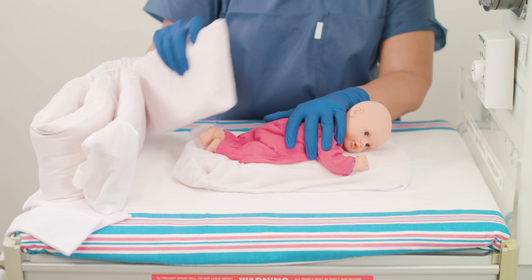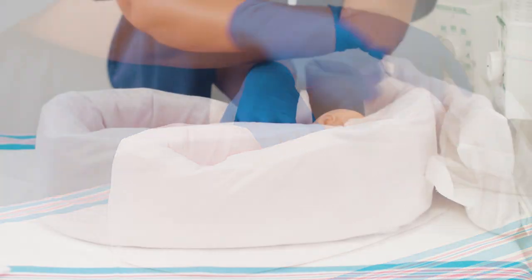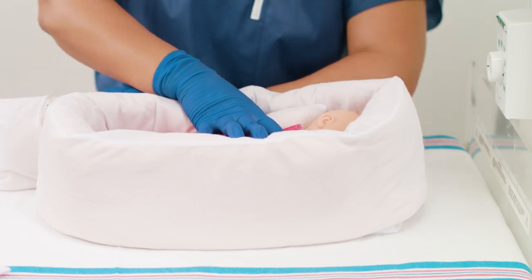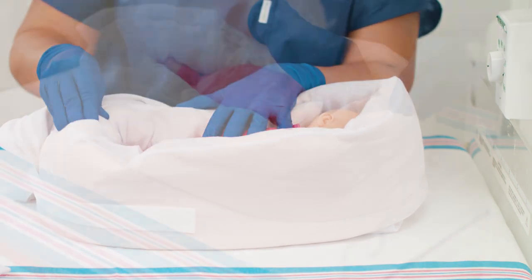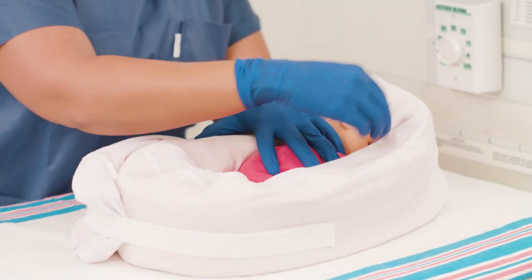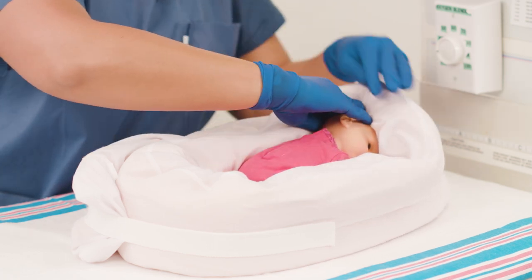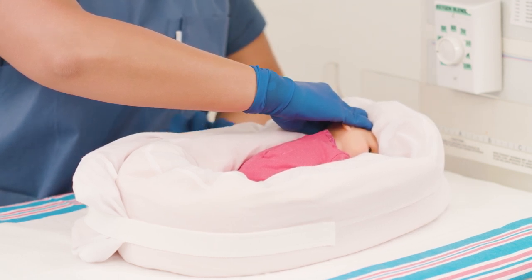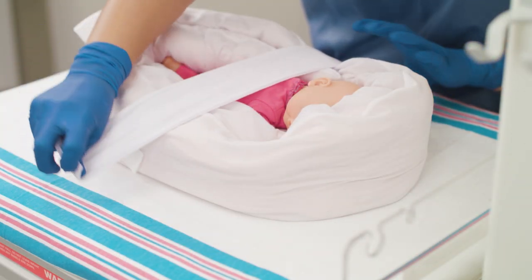Place the tube around the perimeter of the positioner and secure it in position using the attached strap. Mold the tube around the baby on all sides, ensuring the baby is in a flexed midline position with the hips and knees flexed. Depress the positioner around the front of the head so the face area is clear. Create channels to accommodate medical devices as needed, and add the two additional straps to help maintain a contained position.